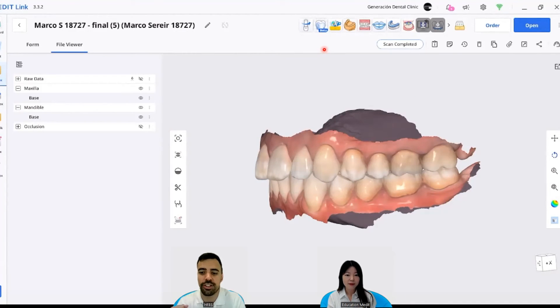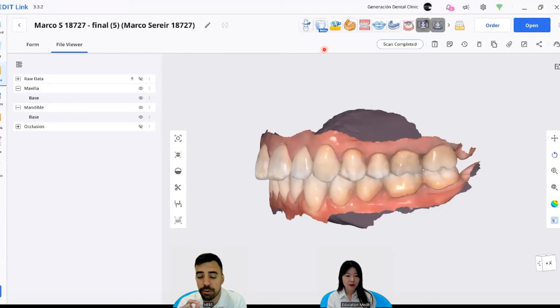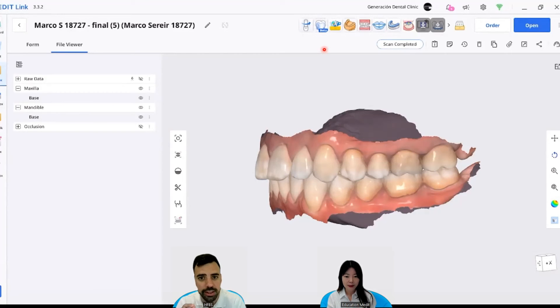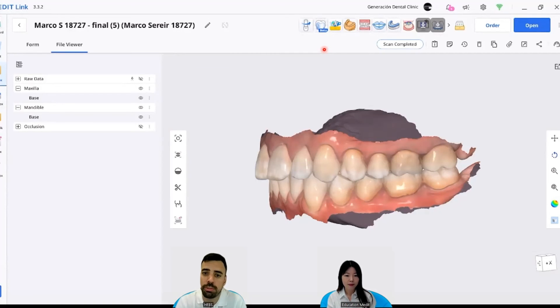So now he feels a lot better thanks to just really simple case, where thanks to the deprogrammer, you can see where the bite of that patient was. And then we can do a treatment according to this.